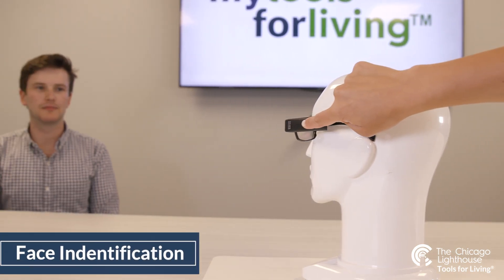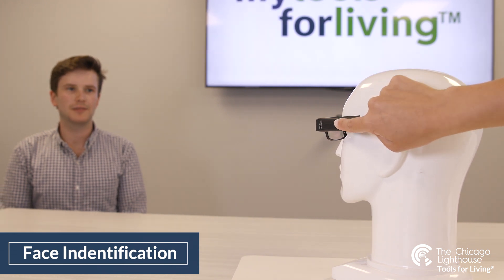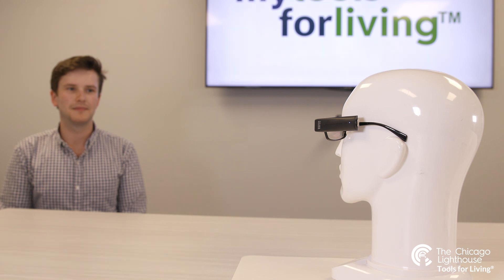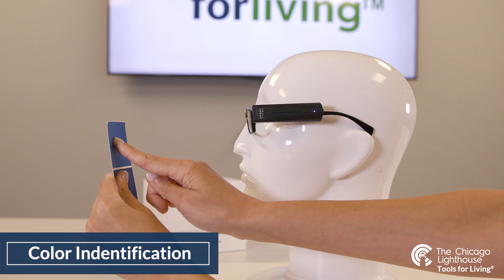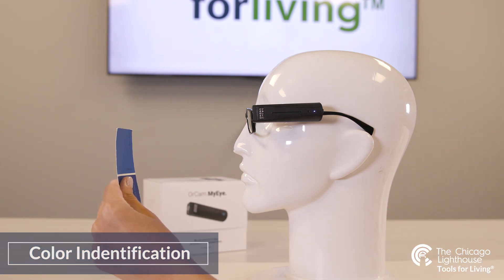The OrCam can identify faces that are added to the device, with the ability to add up to 150 faces. It can also identify colors through a pointing gesture with your index finger, announcing the color of the area being pointed at.